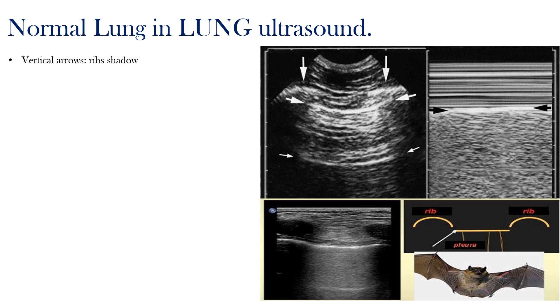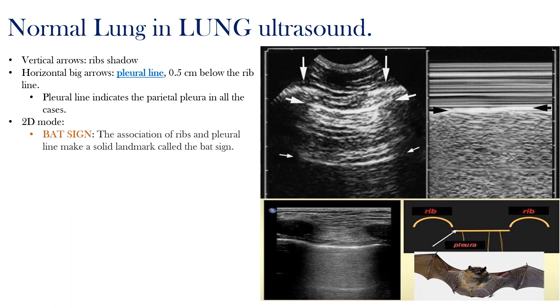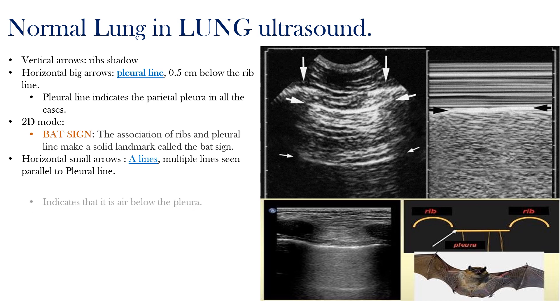The vertical arrows indicate the rib shadow, and the horizontal large arrows are the pleural lines about 0.5 cm below the rib line. The pleural line indicates the parietal pleura in all cases, and we see the BAT sign — the association of the ribs and the pleural line making this recognizable landmark. The horizontal small arrows are A lines, which are multiple lines seen parallel to the pleural line and are reverberation artifacts. Seeing A lines indicates that there is air below the pleura.